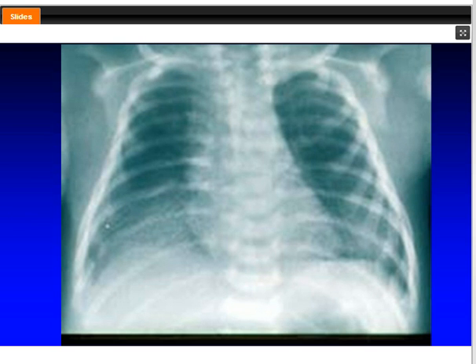This baby actually had group B strep infection, but the upper lobes are normal, so pushing this baby's mean airway pressure would not be beneficial because you would overdistend. Remember that babies with group B strep disease often have pulmonary hypertension, and you want to avoid overdistending the lung because of that.